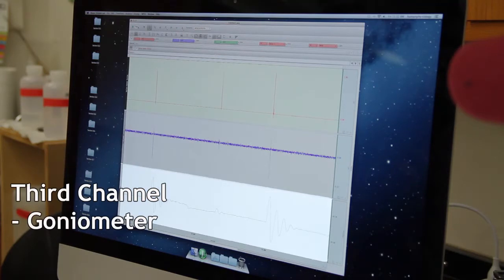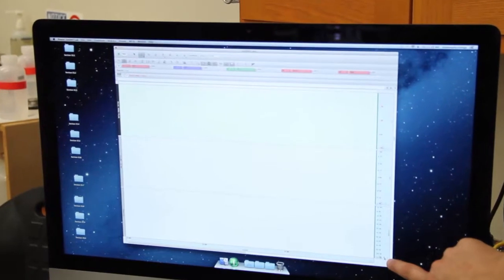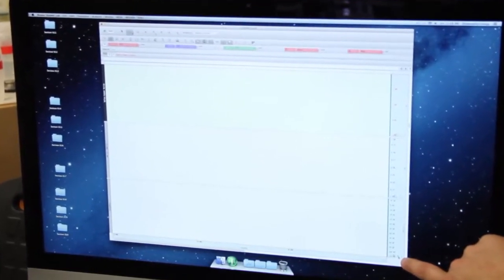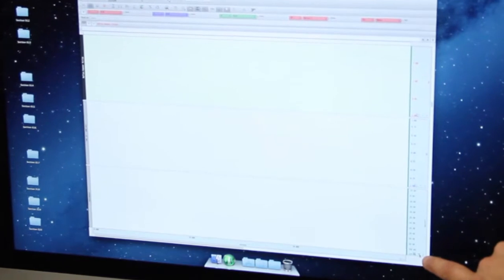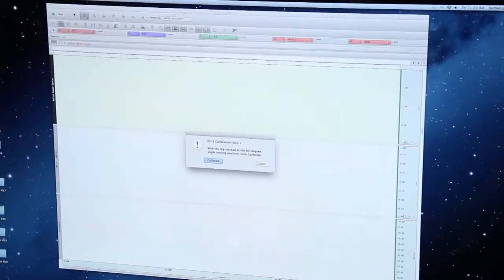We need to calibrate the goniometer for the position it's in on her body. If you look down in the far right corner, it's kind of small, but there's a little wrench icon on that channel. Each channel has a wrench icon, so you need to make sure you are selecting the one that's on the goniometer channel.